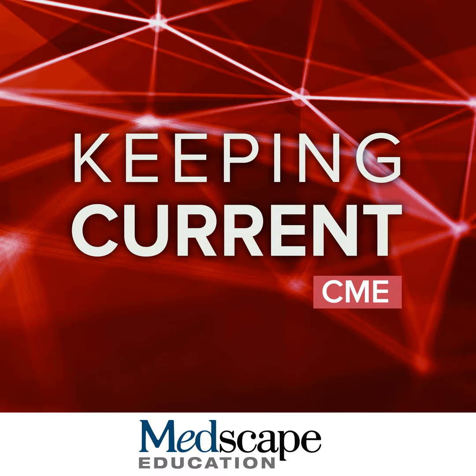So this is a 71-year-old woman with metabolic-associated steatohepatitis cirrhosis who comes for HCC screening. We do a lot of MRI actually for HCC screening. I know it's against the guidelines, but this is what we do. The gadoxetate MRI showed, at the bottom, a small lesion in the posterior aspect of segment 3 that has arterial phase hyperenhancement, but no clear portovenous washout, and isointensity on the transitional phase and HBP, which is shown on the right. And this was categorized as indeterminate liver lesion LR3.